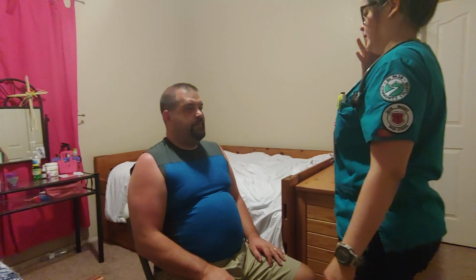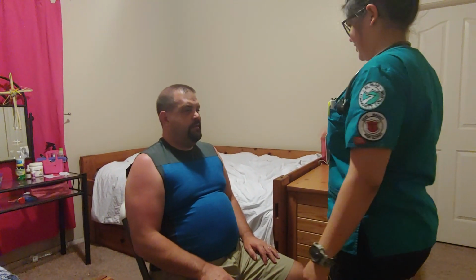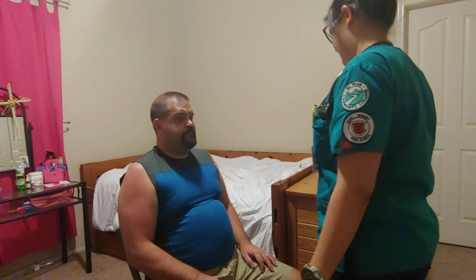I would take the patient's blood pressure using an appropriate size blood pressure cuff and my stethoscope. I would take the patient's temperature orally and then do the patient's oxygen saturation, and then I'd take their height and weight.